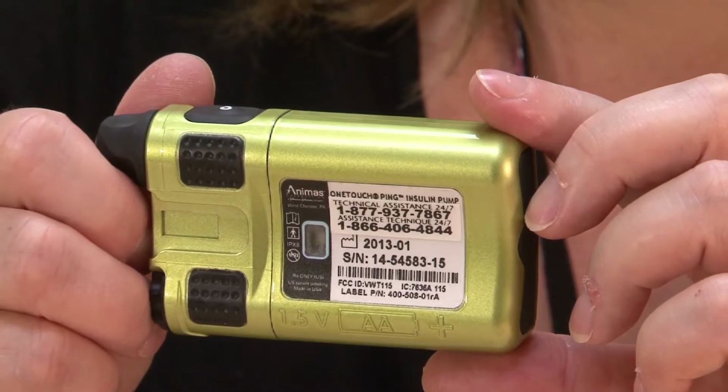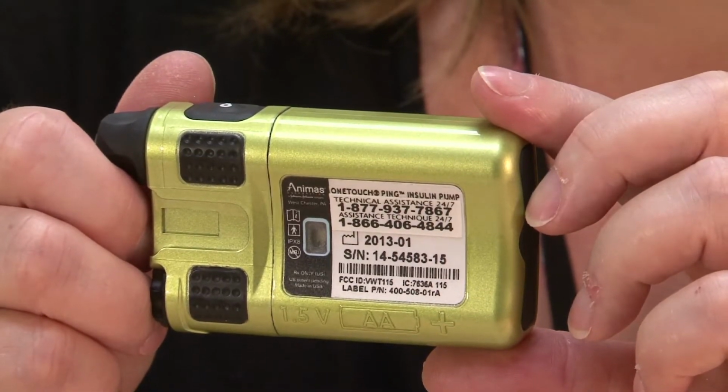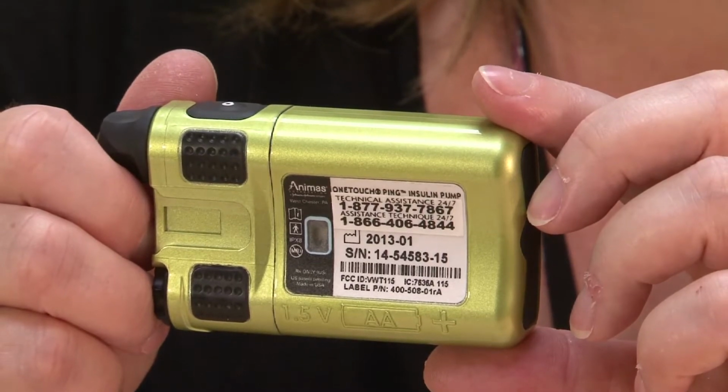On the back of all of the pumps are 1-800 numbers. They're a technical support line. Certainly they're not going to offer advice on managing blood sugars, but they can offer technical advice on button pushing and advice to do with the tubing and insertion sites with the pumps. The 800 number is right there, and then any personal information about your pump, like the reference number or whatever would link this pump to you, is on the back. So if you need to call them, anything you need is always attached to you.